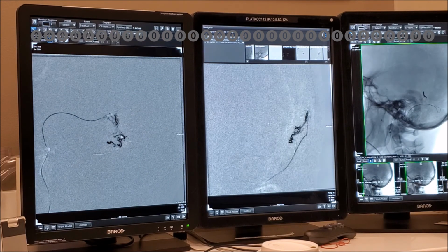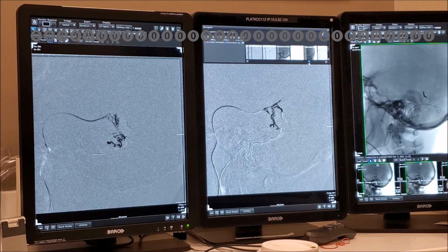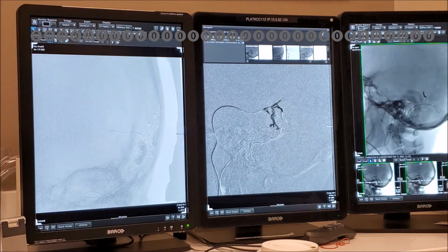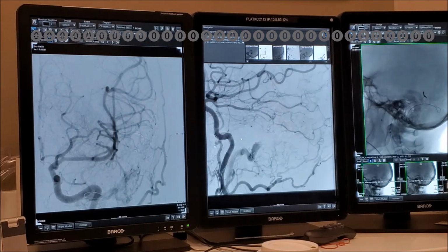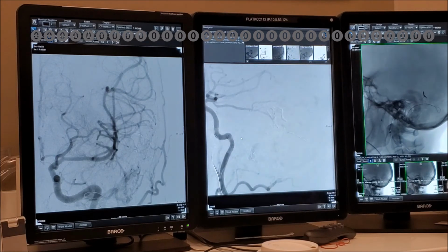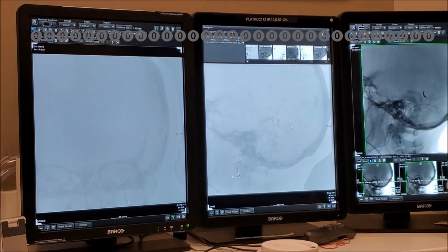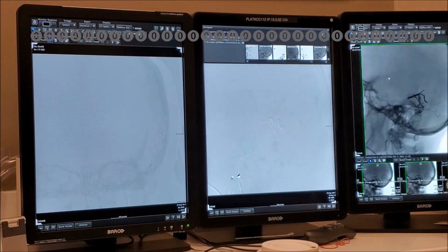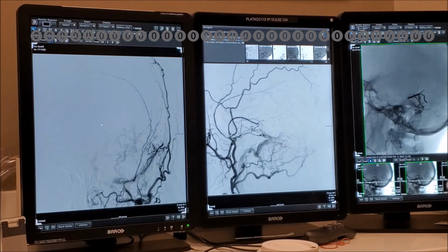This is nice. You see how you're getting part of the occipital. That's better than the angio. And this is post. Balloon still inflated at that point. Yeah, that's easier. So this is where you stabbed. Yeah.